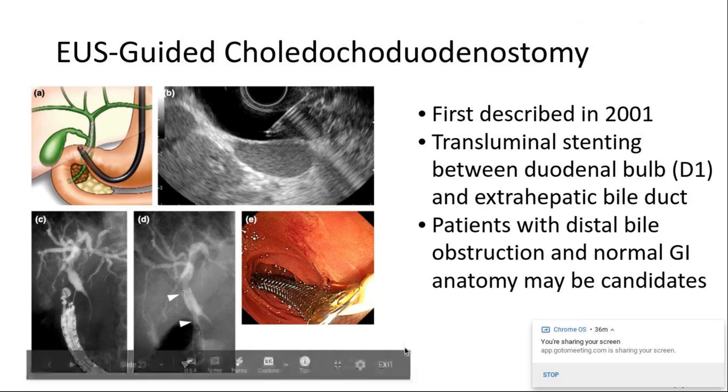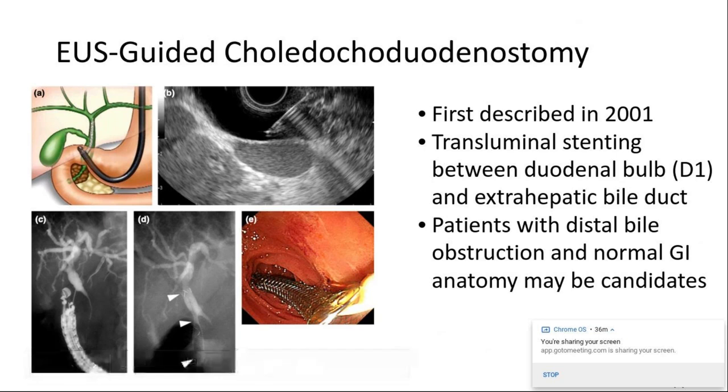So, in addition to the common rationale for employing EUS-guided biliary drainage, there's quite a specific rationale for going for a choledochoduodenostomy. The common bile duct is much more easily imaged under EUS than the intrahepatic bile ducts, in contrast to what happens in transabdominal ultrasound. This means they can be imaged and accessed under EUS without added risks, even in patients with minimal or no bile duct dilation. In patients with dilated bile ducts, the common bile duct is a much more obvious target for puncture than the intrahepatic ducts. This results in faster, cleaner access without repeated puncture attempts, thereby minimizing risks.